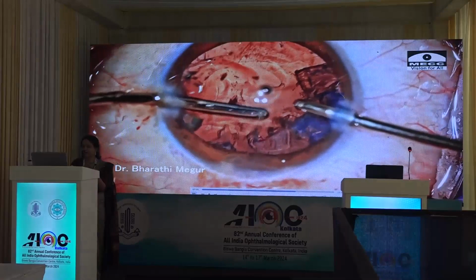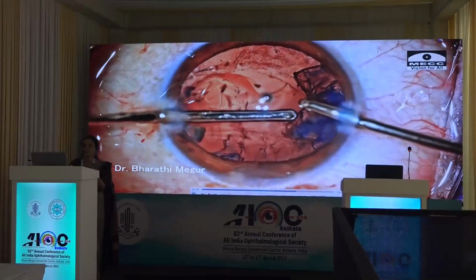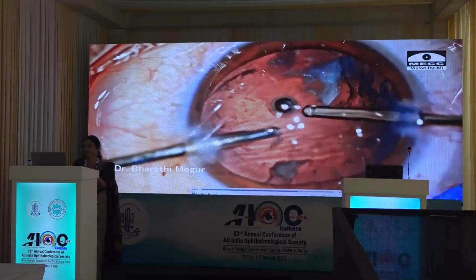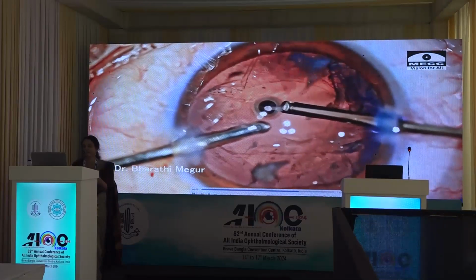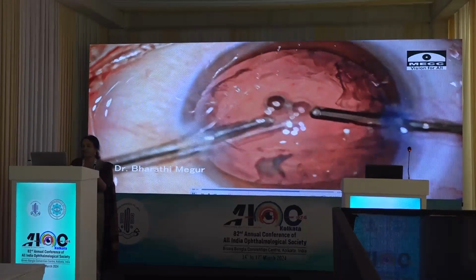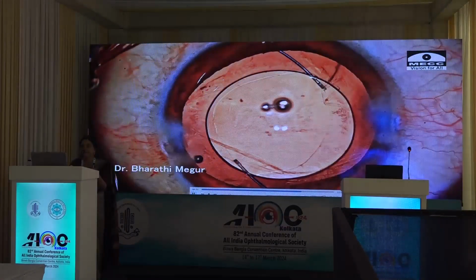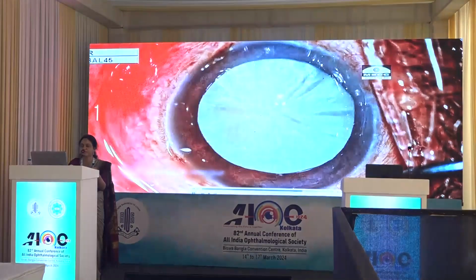So I noticed at the very last stage of cortex removal that there is probably disturbance of the vitreous. I used triamcinolone acetonide again here with the diluted 1:4 concentration. I identify that the vitreous is disturbed. It is a tad bit difficult to identify vitreous disturbance when you have used in excess viscoelastics, but with a little bit of clinical surgical experience it is easier to identify, and as such triamcinolone acetonide is a great tool to identify vitreous disturbance. That was the final picture after the IOL implantation.